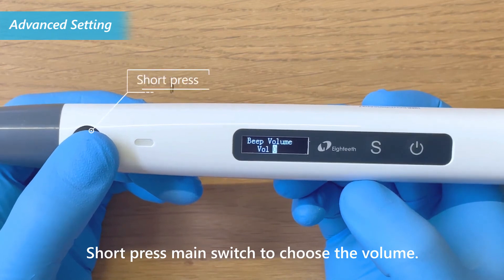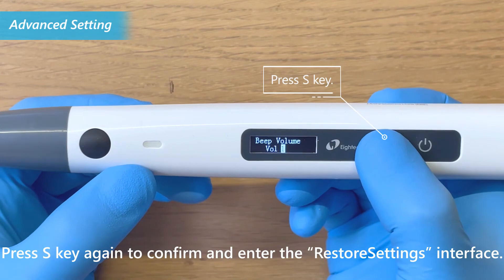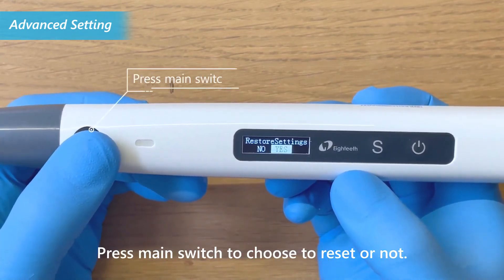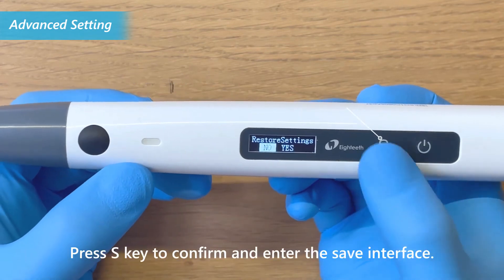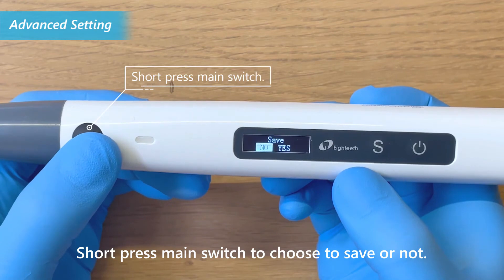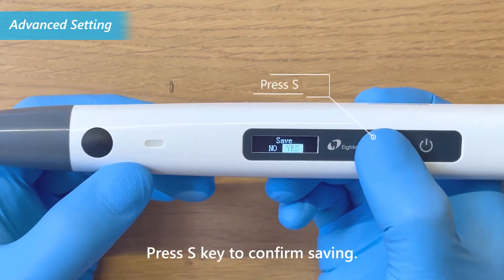Short press the main switch to choose the volume. Press the S key again to confirm and enter the restore settings interface. Press the main switch to choose to reset or not. Press the S key to confirm and enter the save interface. Short press the main switch to choose to save or not, then press the S key to confirm saving.